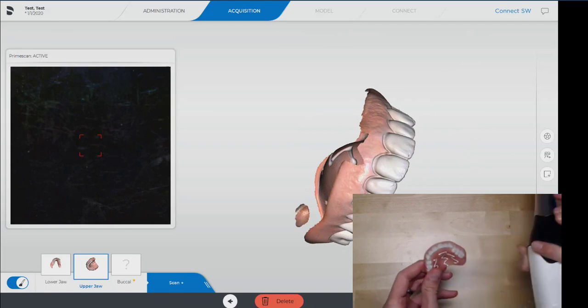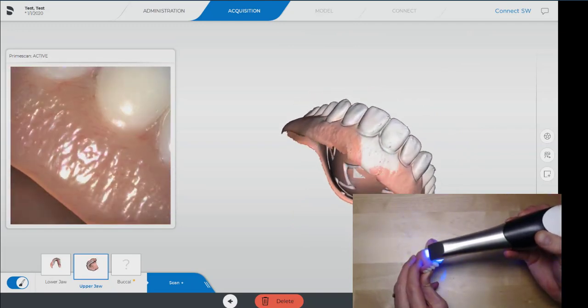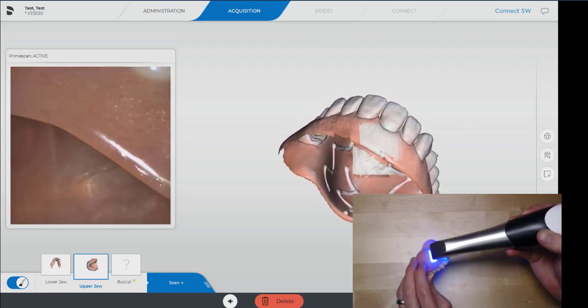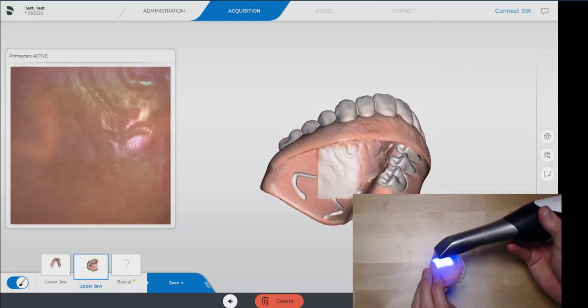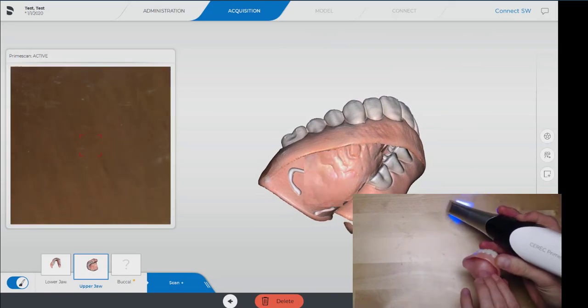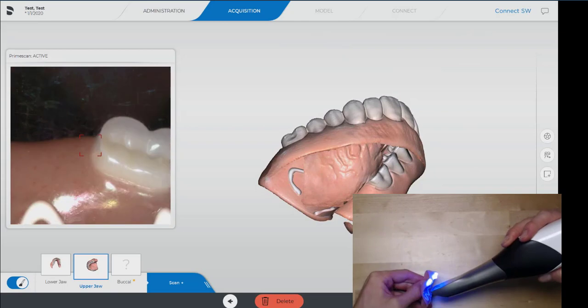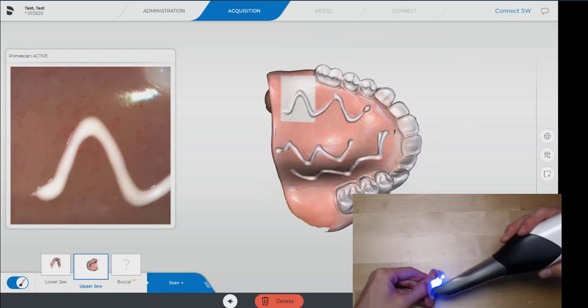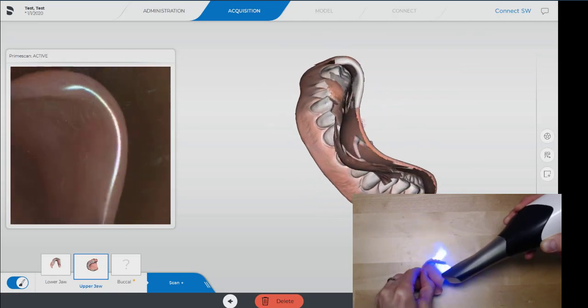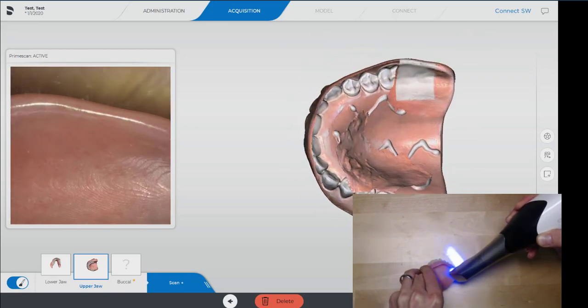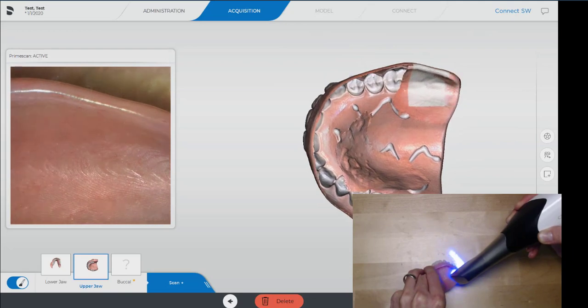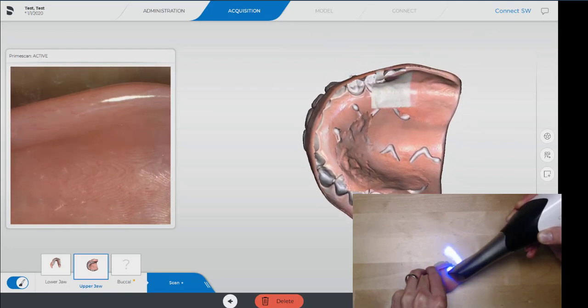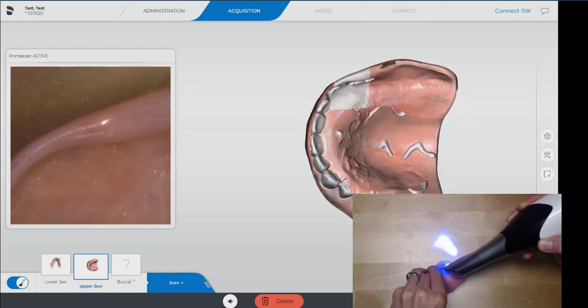Looks like we're coming along nicely here. Going to come up to the anterior and catch that. There we go. Now I just need to find a good place to roll it around to the inside. There we go.